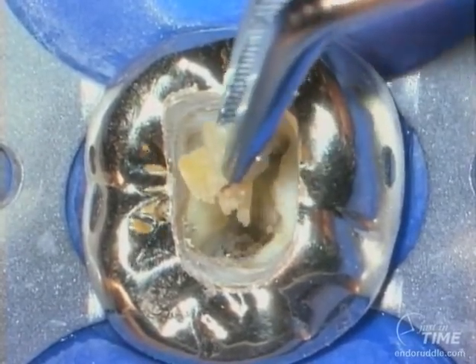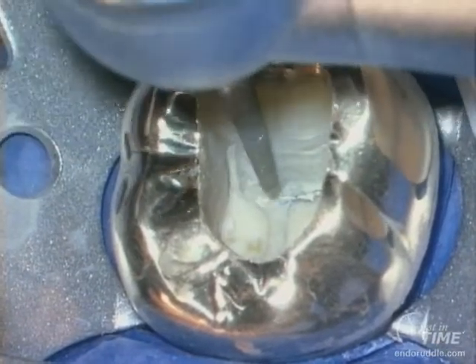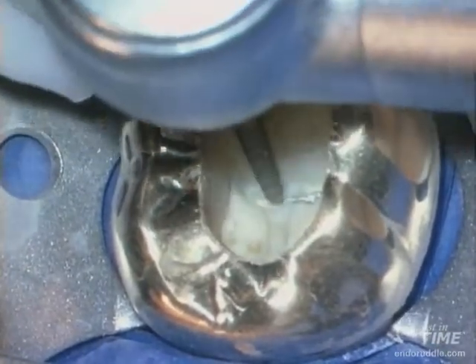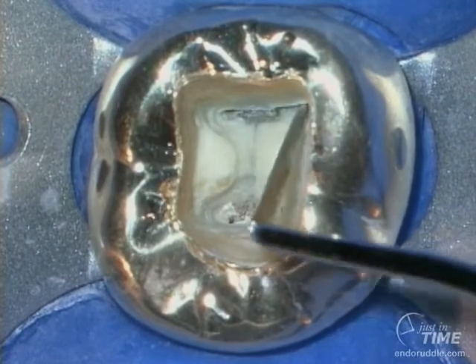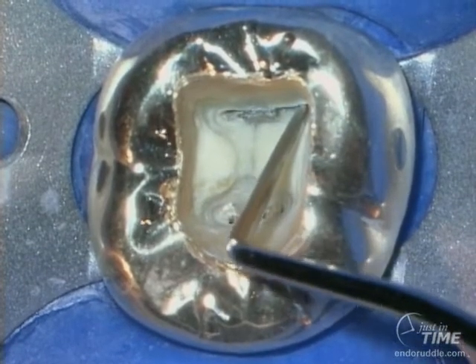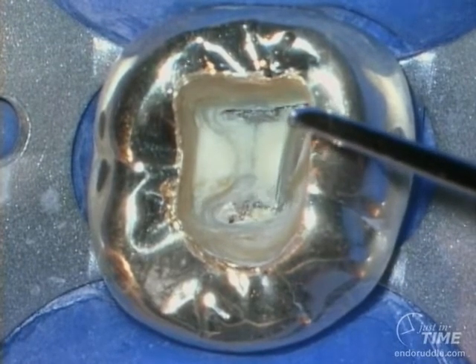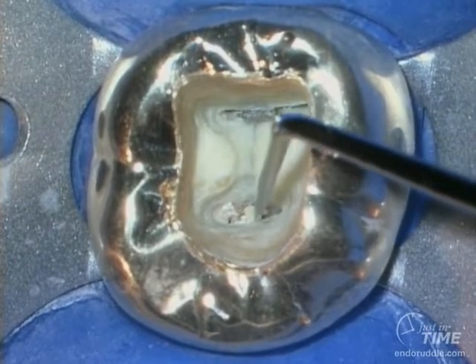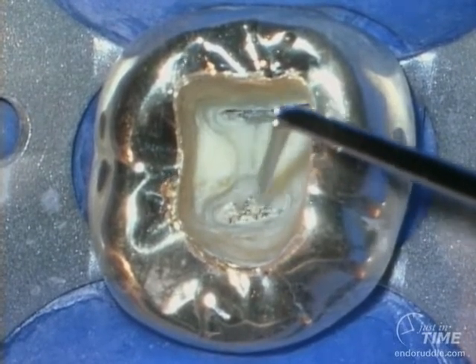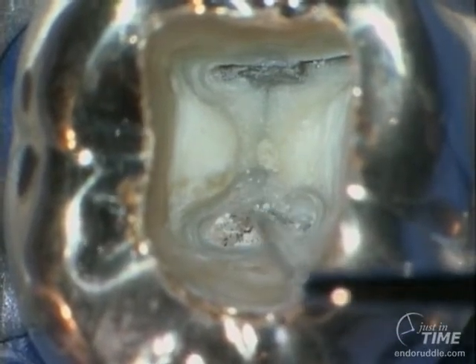Notice the occlusal-gingival dimensions. Anybody can cut a hole into a tooth, but great clinicians like to finish those holes superbly. Notice the walls are all nice and flat — this allows us to reflect light off those walls so we can see pulpal floor anatomy better. You can notice that there are more denticles overlying the distal systems, and an explorer is beginning to tease out a small denticle that could inadvertently get pushed deeper into the canal if we don't take the time to thoughtfully remove these stones.